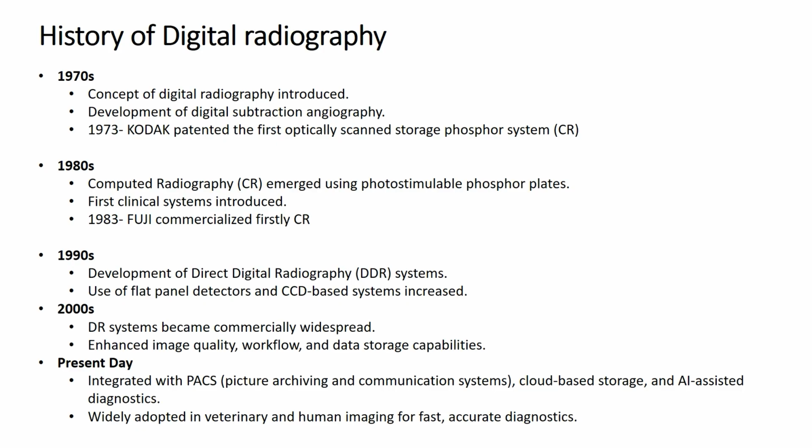In the 1990s, the direct digital radiography system was developed. Under this direct digital radiography system, flat panel detectors are used and CCD based systems increased.